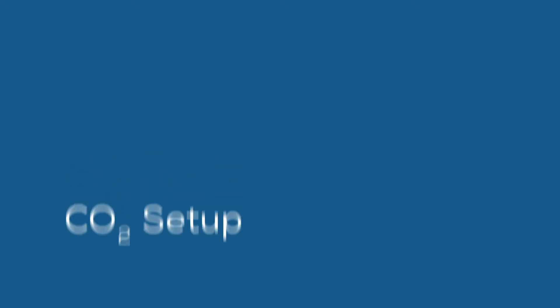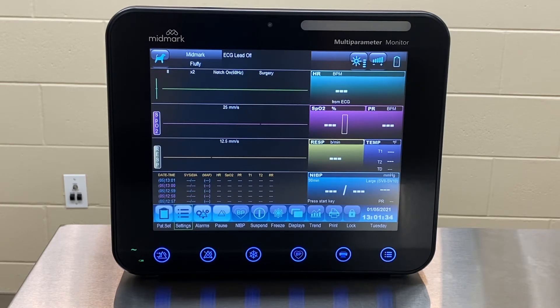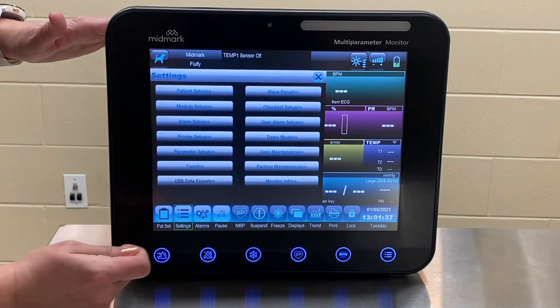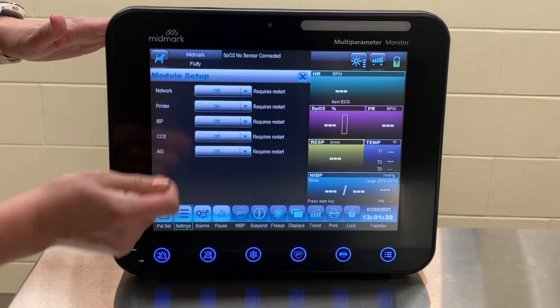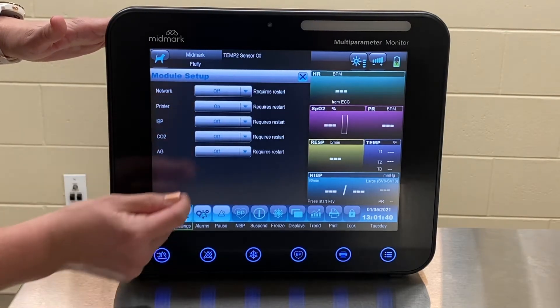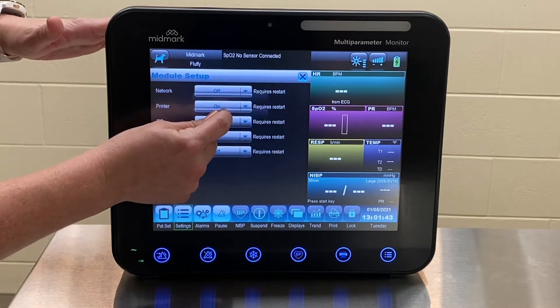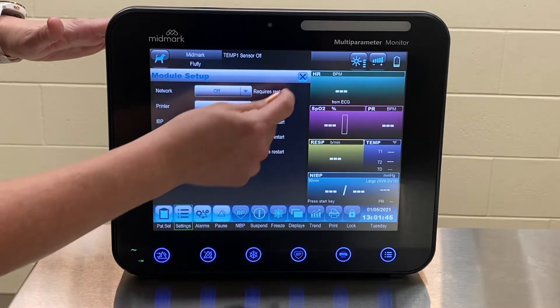If a CO2 module was purchased, it must first be activated in the menu and zero calibration should be done. To activate the module, press Settings, select Module Setup, expand the drop-down option next to CO2, and select On to turn on the module.